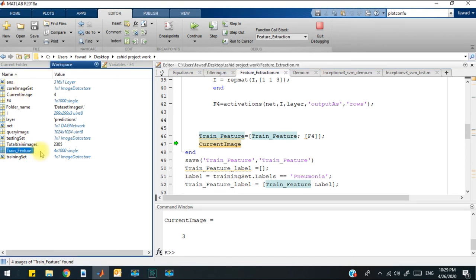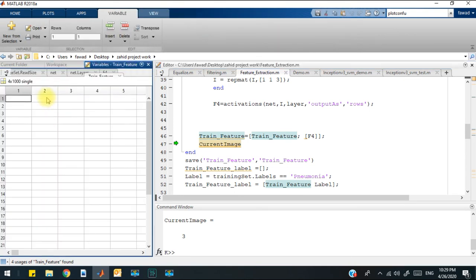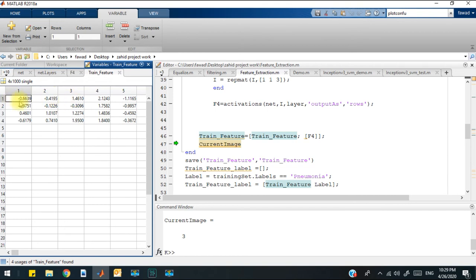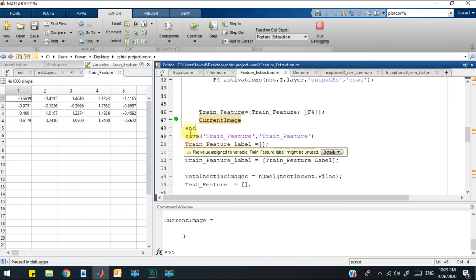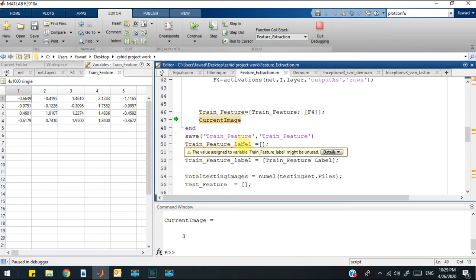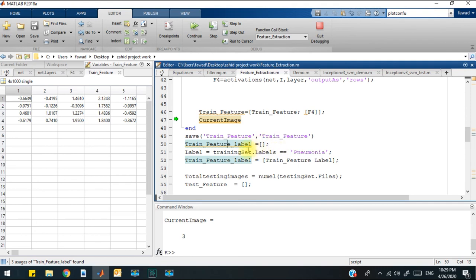After that, we will save these train set of features, and after saving the train set of features, we will concatenate the label with the training features.